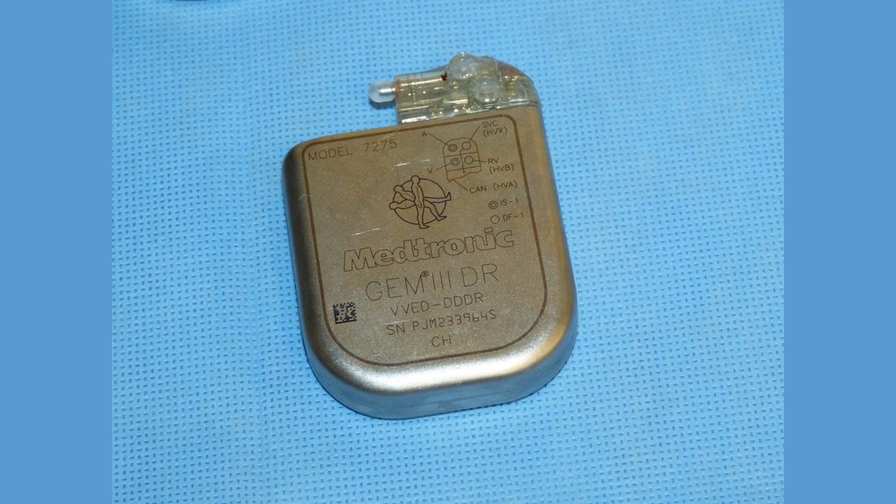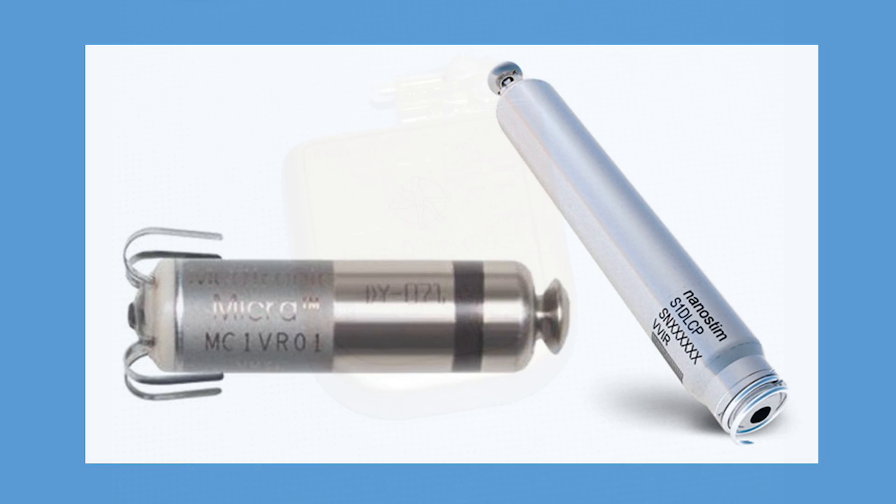Today I'll be talking to you about heart pacemakers. A pacemaker is a small electronic device that generates electrical pulses to prompt the heart to beat at a normal rate. It is usually placed in the upper part of the chest under the skin, and more recently a new line of pacemakers are implanted directly into the heart chamber through catheters.